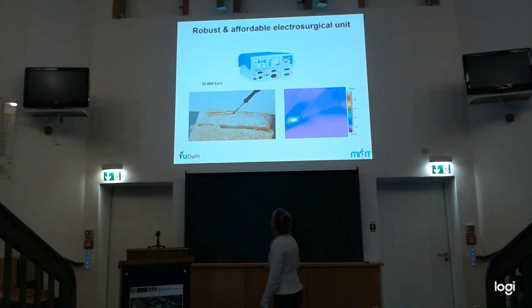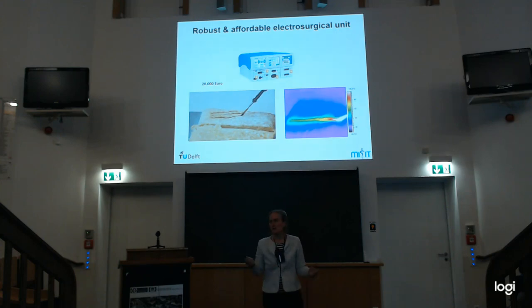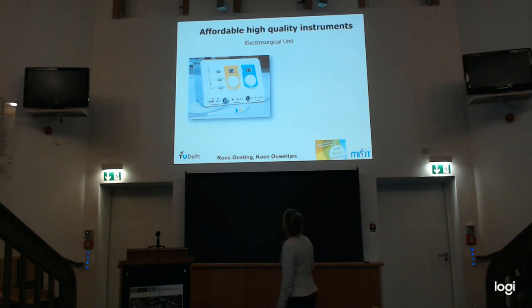electrosurgical device. It costs between 10,000 and 50,000 euros, which is really expensive to buy. Then we looked at how it is used in our hospitals. We see it has all the buttons and settings, but mostly only two or three are used. The other things are not used, also not in our hospitals. So why not use a simple one, and go through it together with the students, asking them how they would like an interface to look, to see what works? You can have this solution. It's easy to get from one wire to another, because that's what they do.